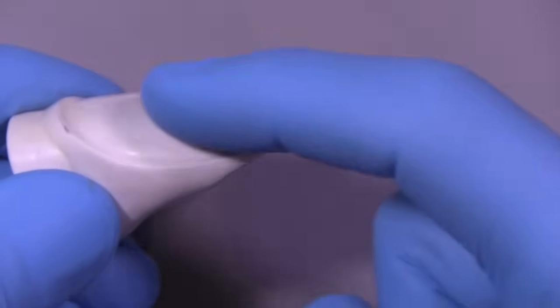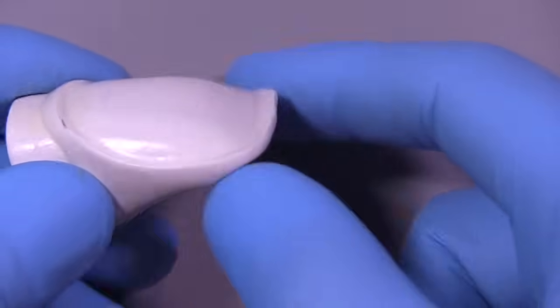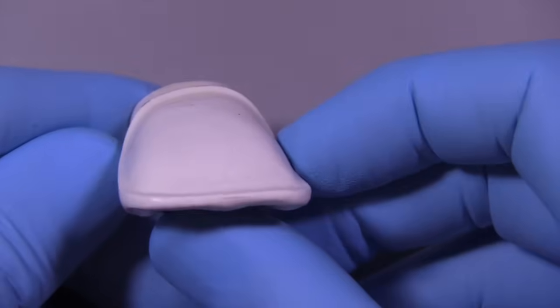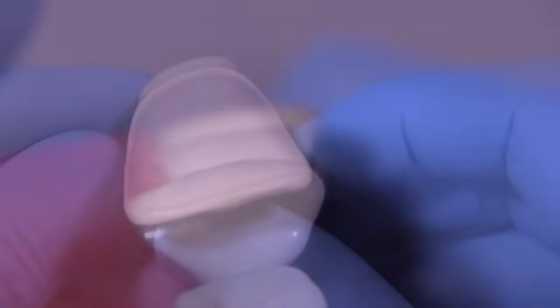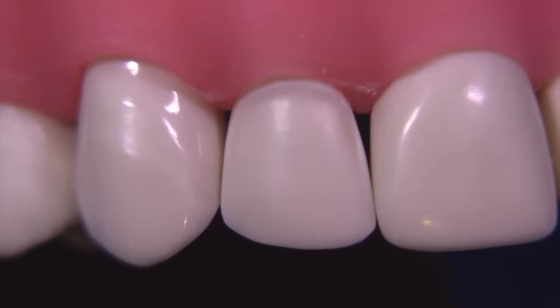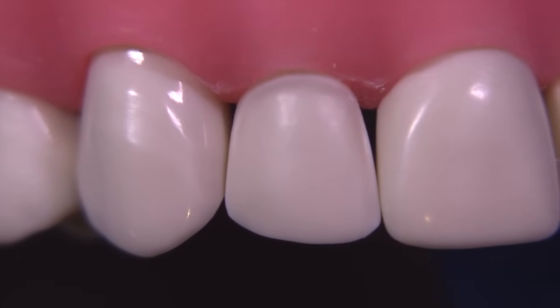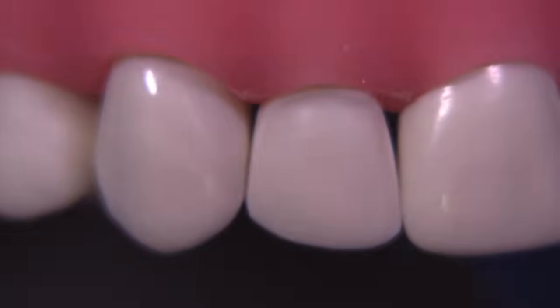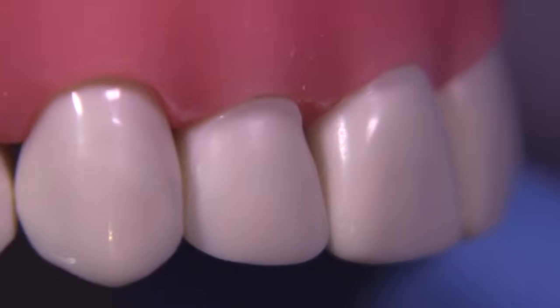So I think that Dr. Albers, I want to thank you for your beautiful work, but we did make a modification of our design today, and I think that we both would be happy with the result. So here we have this smooth incisal corner where we haven't wrapped around, but we've just kept that edge nice and clean, and the final veneer preparation is meeting our needs today for our aesthetic dentistry.